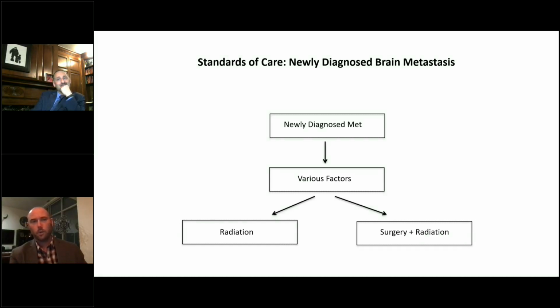It goes back to that point of, there isn't a classic prospective extent of resection or extent of coverage literature here, but I would employ the laser the same way you think about surgical resection. And if you have the practice of trying to be super marginal with your resection, go beyond the contrast enhancing area into some of those T2 bright, flair bright areas, if you're in an area that's safe to do that, I think I would employ the laser much the same way.